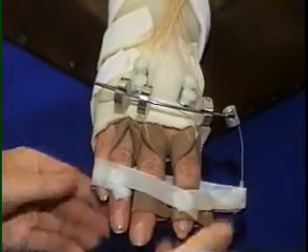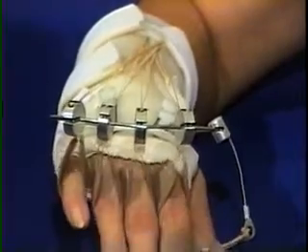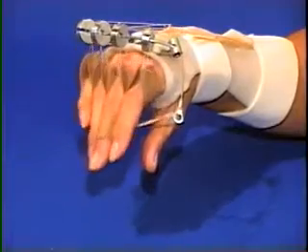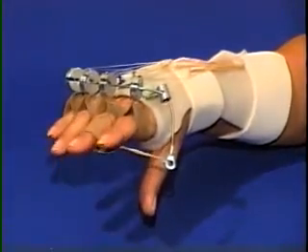The use of the Phoenix Outrigger creates a lightweight, comfortable splint, convenient for the therapist when readjustment is needed and convenient for the patient because it eliminates many of the clothing difficulties caused by a larger splint.